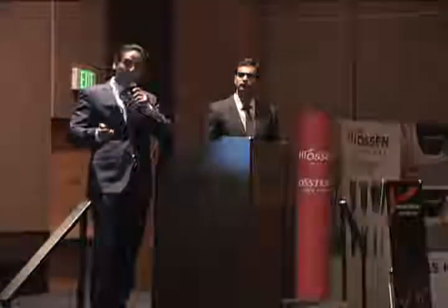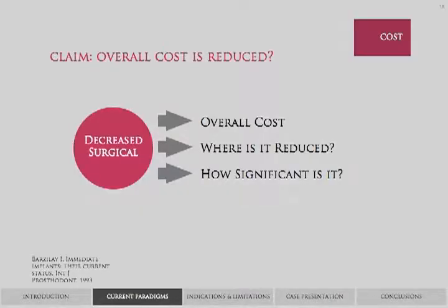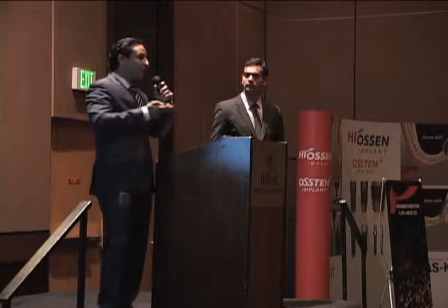Now, is overall cost reduced with immediate implants? Probably not. You're still doing the same procedure. You're still temporizing perhaps, and putting in bone graft and membrane. We're not like lawyers who charge for chair time. If we have to uncover, we do it and charge per case. So I don't think we really notice a difference in cost if we place the implant immediately.